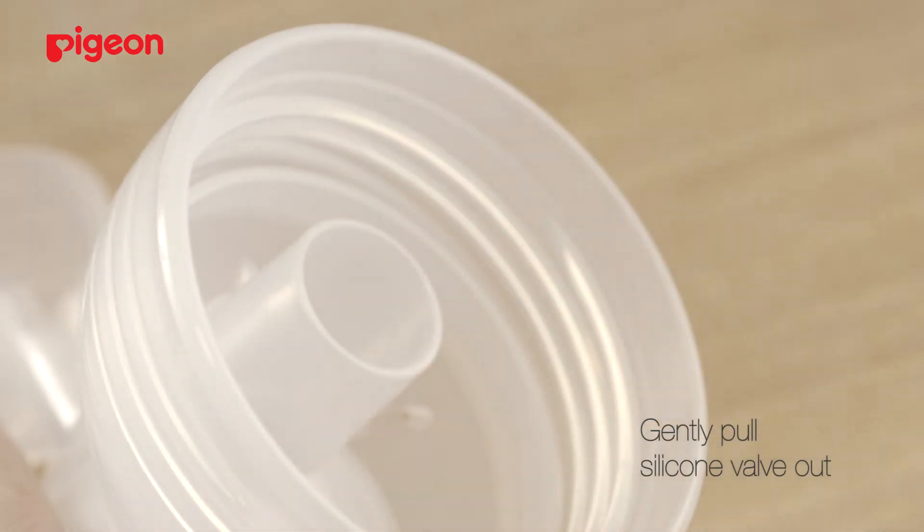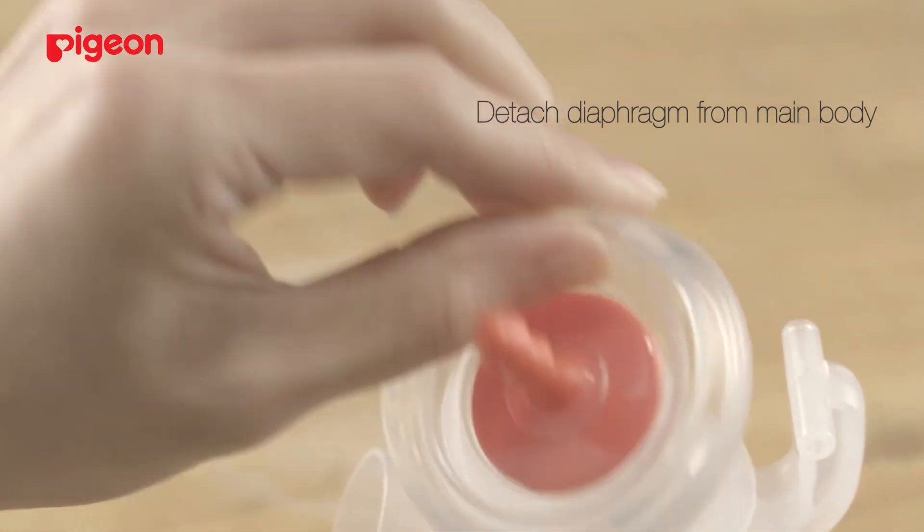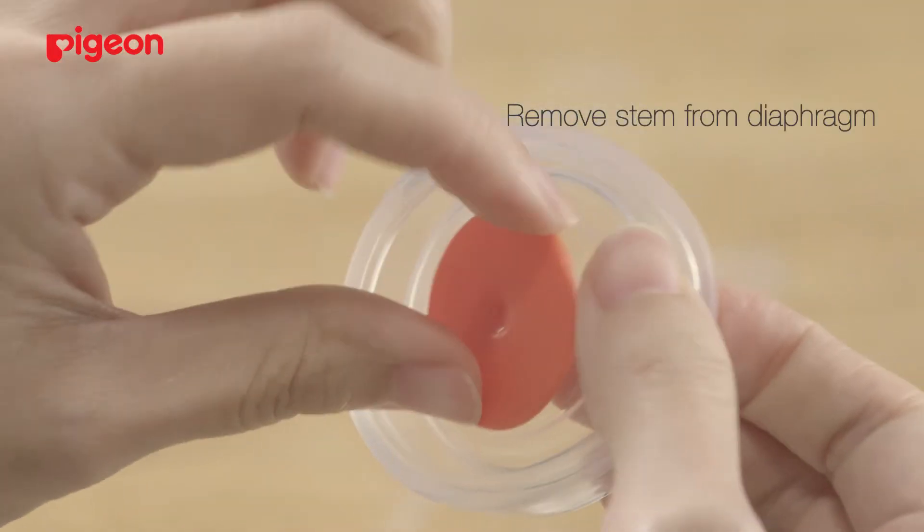Gently pull the silicone valve out. Detach the diaphragm from the main body and the stem from the diaphragm.